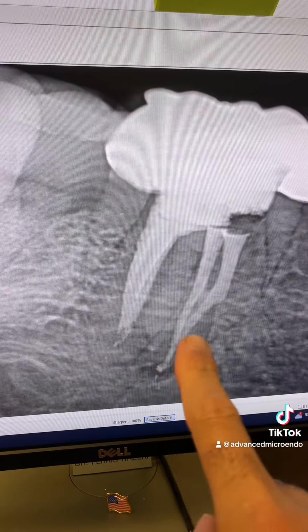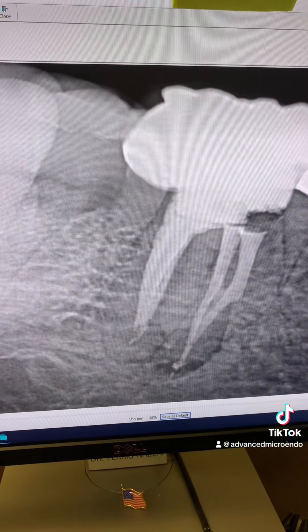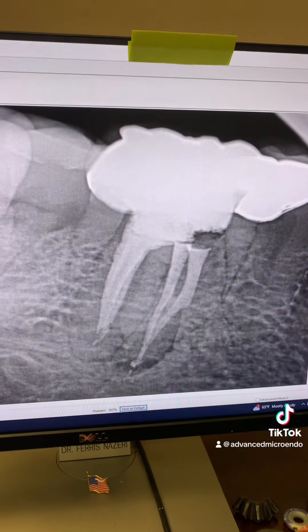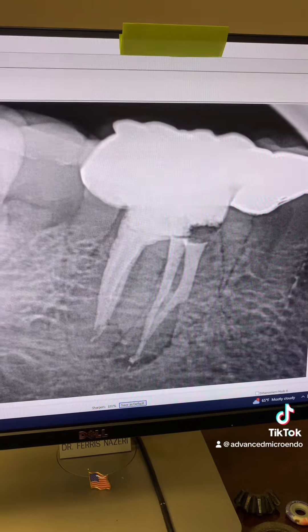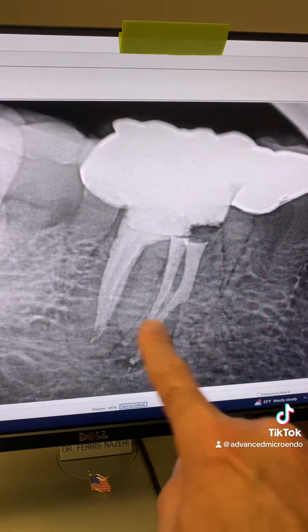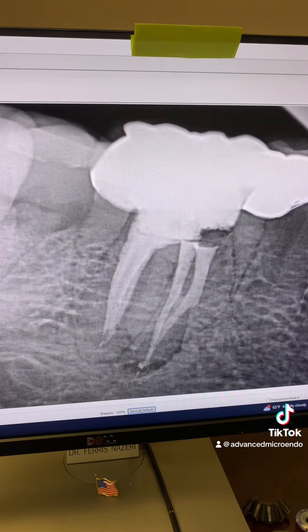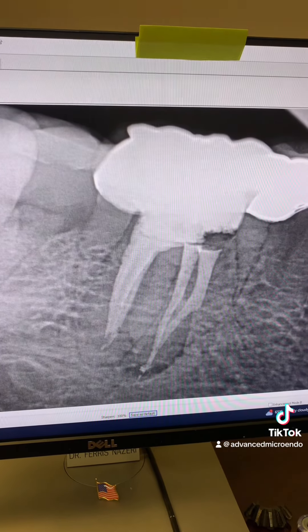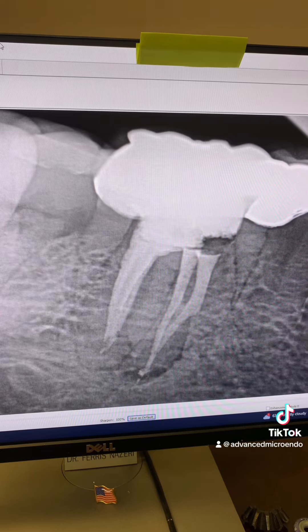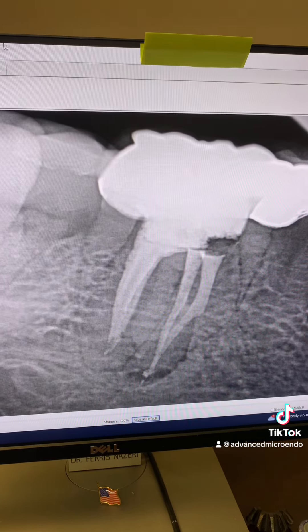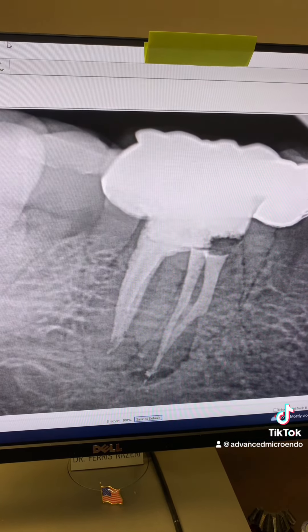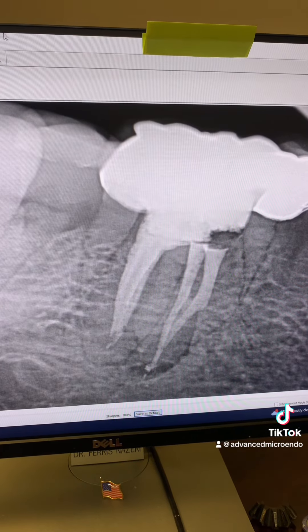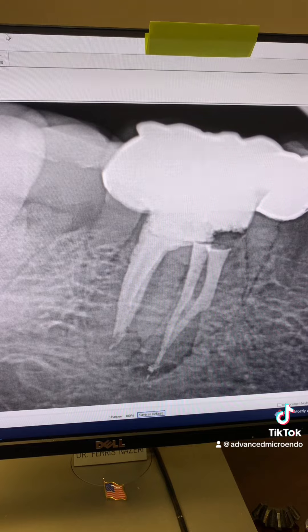I was able to obturate it three-dimensionally. We did this in one appointment, despite the fact that there is a sinus tract and active infection. So we redid the root canal in one appointment. Hopefully when the patient comes back in six months for a post-op check, I will post that video.